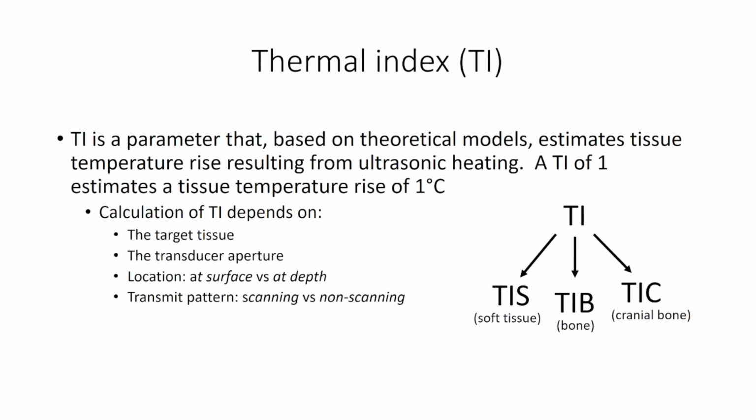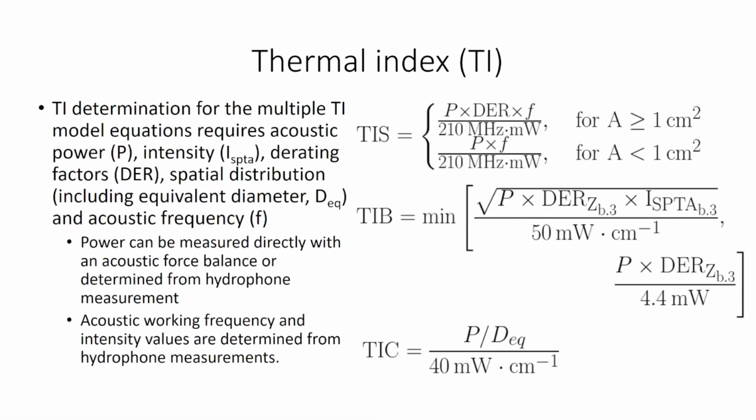While the models themselves make some quite significant assumptions as to heating in tissue to simplify the ultimate calculation of the thermal index, the measurement and calculation process is still quite complex, as I believe is well illustrated by the equations on the right-hand side of this slide, which are not a complete set.